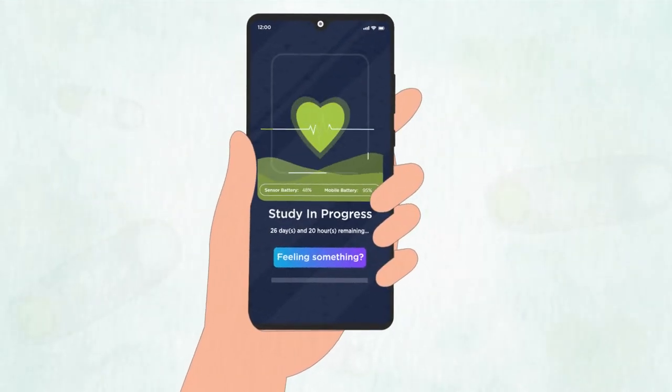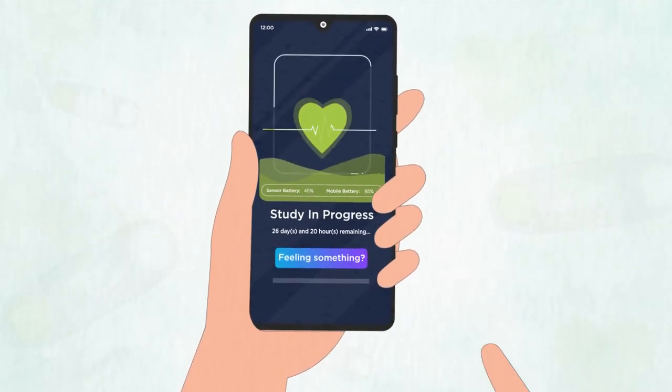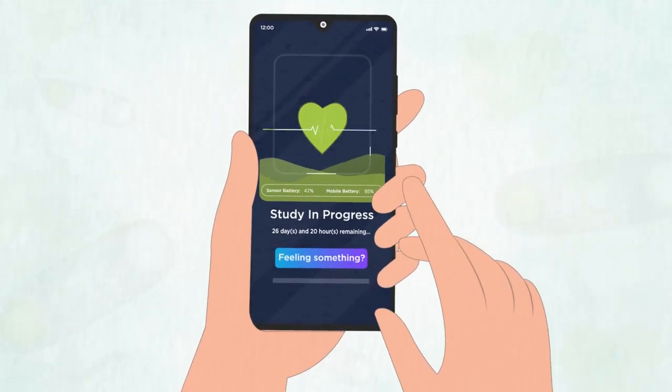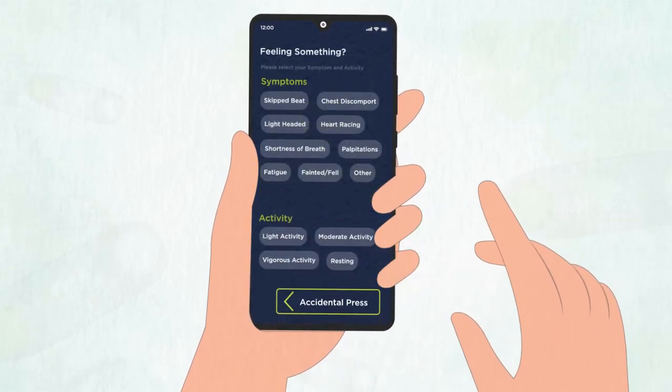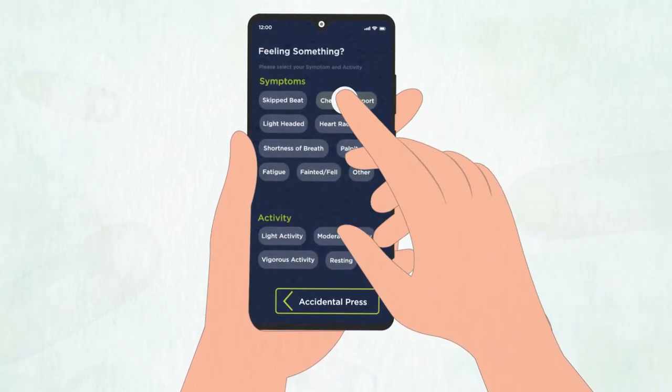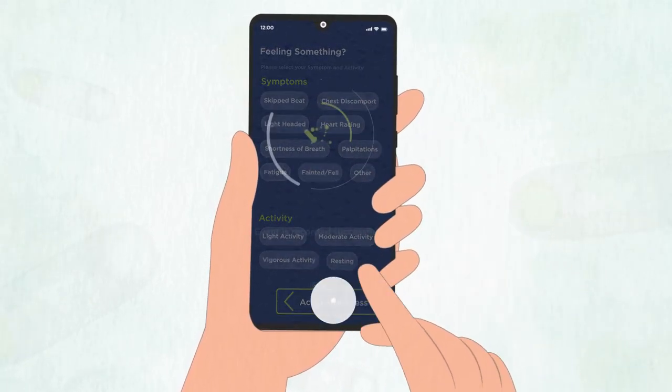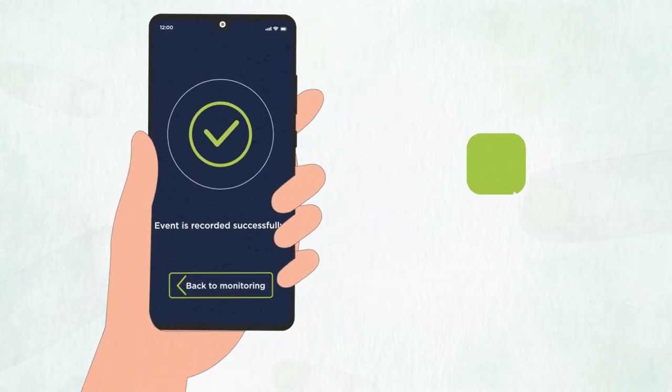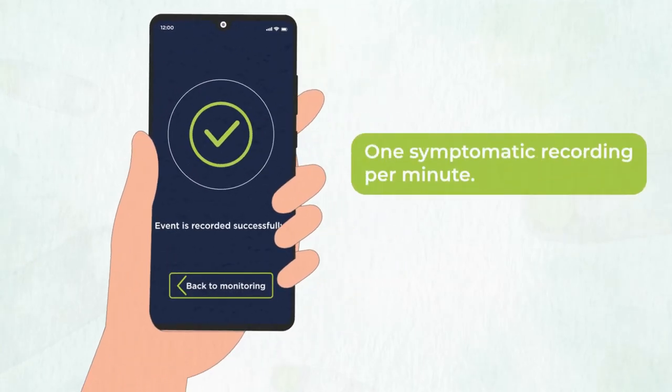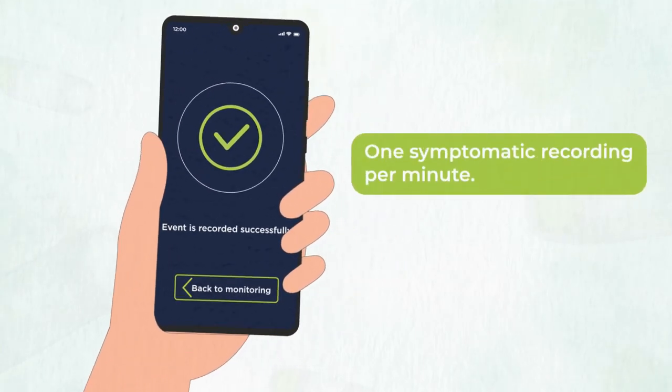If you feel a symptom during your study, use the app's Feeling Something button to record it. You can only send one symptomatic recording per minute.